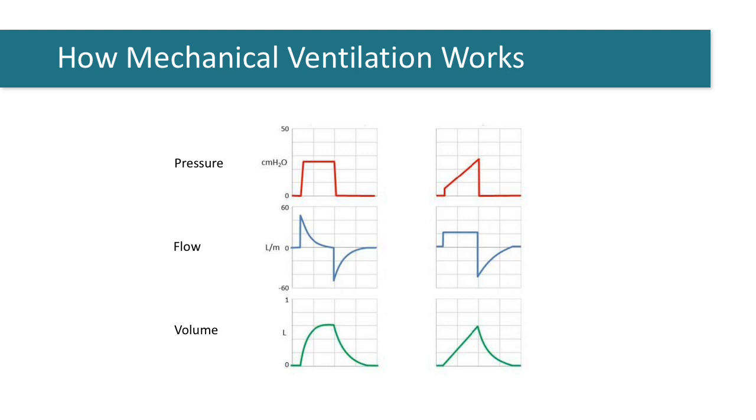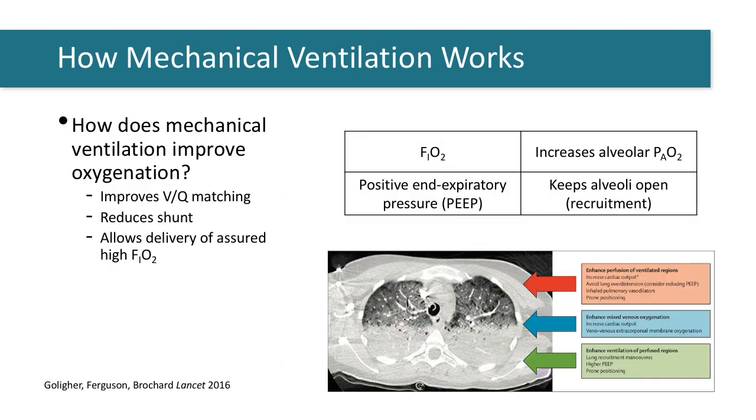And the limit defining expiration is tidal volume. So you can see that with the constant application of flow, tidal volume progressively rises until the peak is reached. And at that set inspired tidal volume, the ventilator knows it's time to stop delivering inspiratory flow and cycle into exhalation. You can see here that the pressure progressively rises.